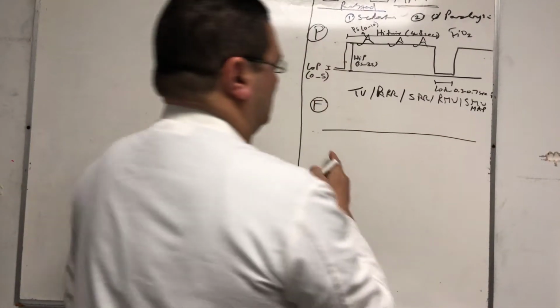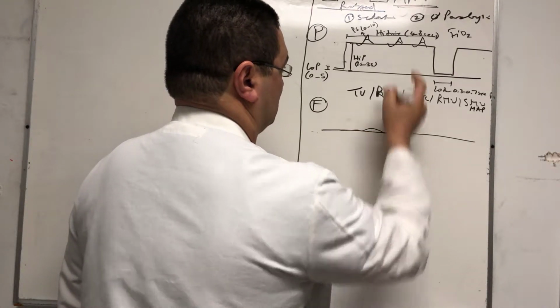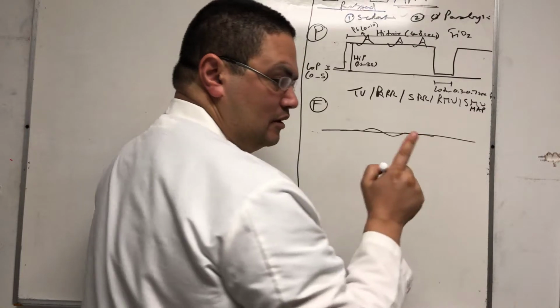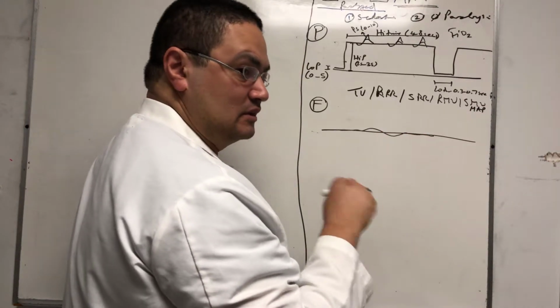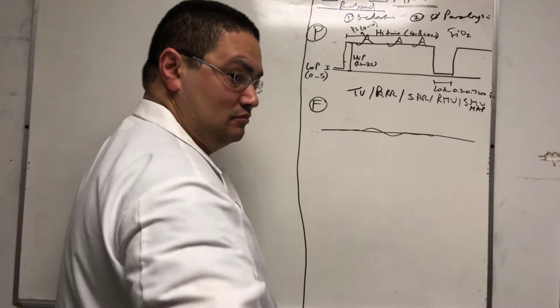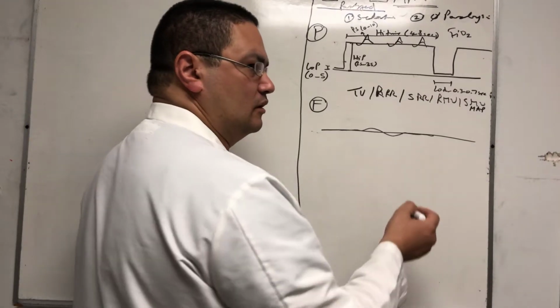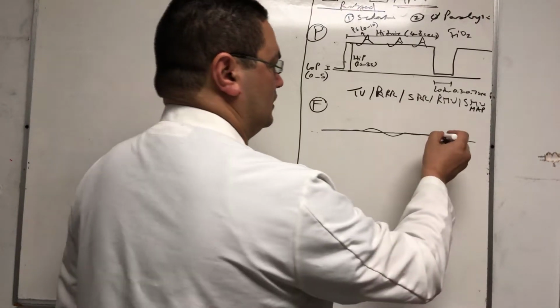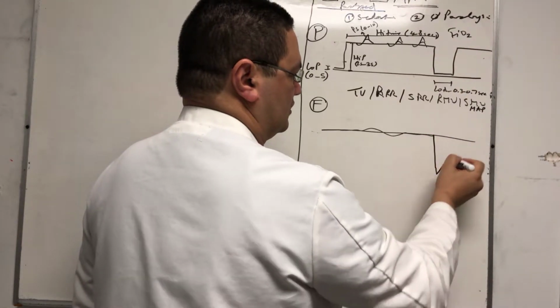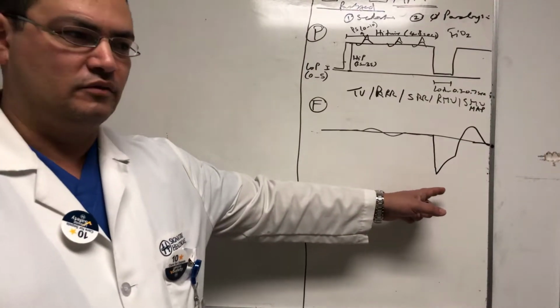So, how does the flow waveform look? It looks like this: no flow, or minimal flow, just like this. Maybe for those breaths, minimal. And then when it comes to the release breath, terms are very important, by the way. When we say release breath, it's release breath. I'll show you in this lecture that you can actually kill patients if you change the term, right? So the release breath goes down like this, right? So weird mode of ventilation, right?